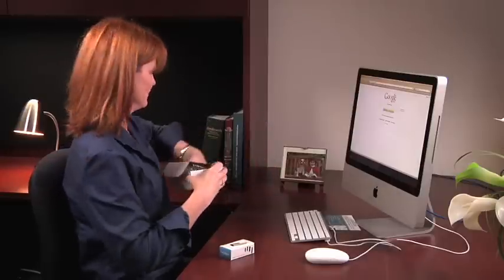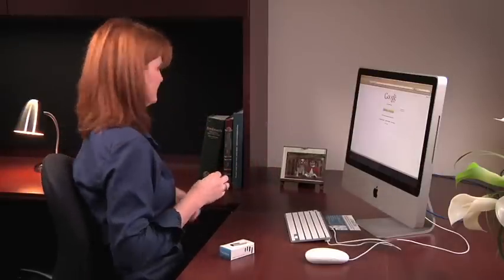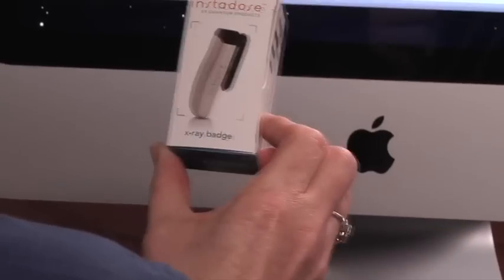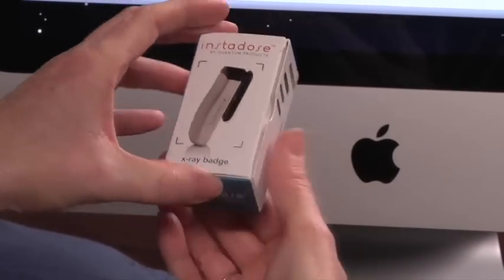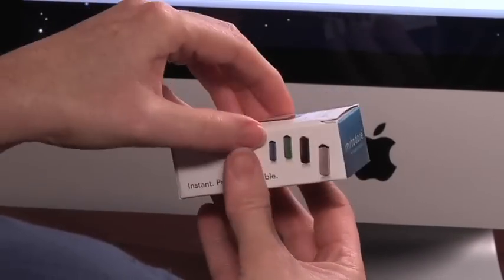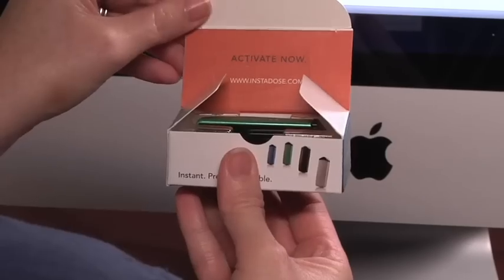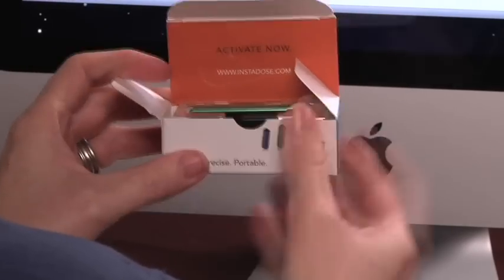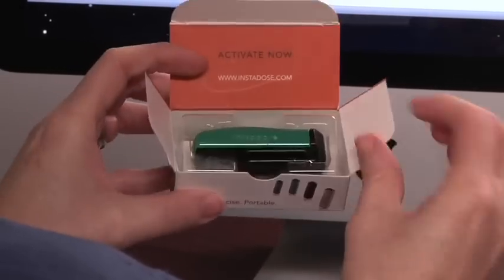With AMP, account administrators can manage all the elements of the InstaDose Monitoring Program online — from account administration to managing individual wearers and devices. AMP will give you real-time access to all of your account information.